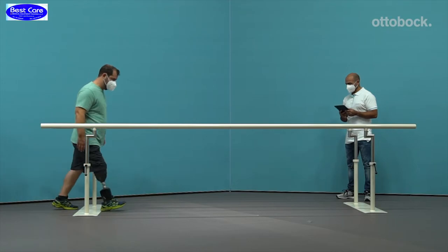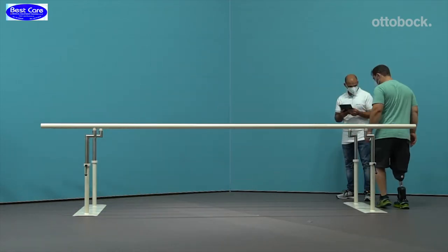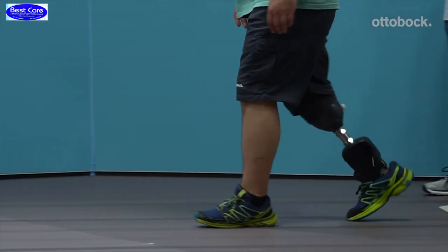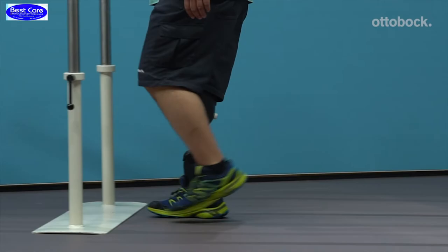The adjustment of this setting affects how fast the foot is plantar flexed during loading of the limb. Increase the resistance if you observe foot slap or if there is no knee flexion observed during the loading of the limb.